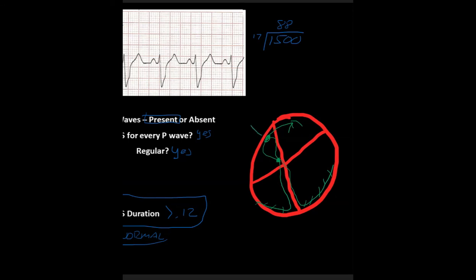So we have our conduction system. So let's start off. Here is our P wave, right? So this is coming from the SA node. And we know that this is firing okay. It's at 60 to 100 times a minute. So this is why immediately we have to now call this sinus. Then we measure our PR interval. And we'll just do it this way, right? So we're going to measure our PR interval. This is from the beginning of the P wave to the beginning of the QRS complex.